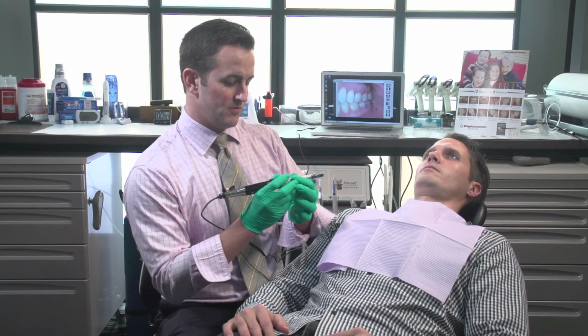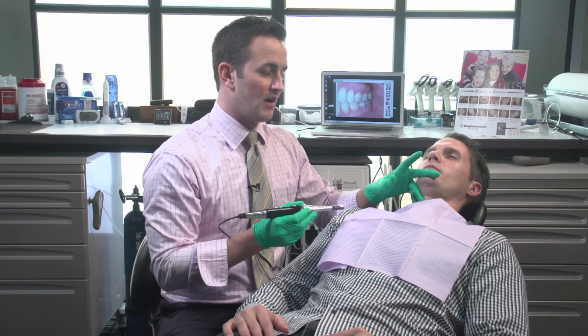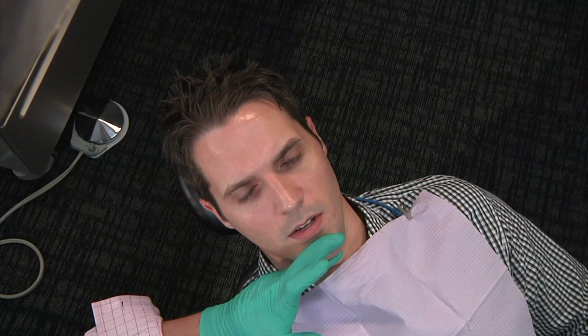Camera's already on too. Now with your opposing hand, we're going to place the middle finger off the labiomental groove and basically pinch down on the chin. Have the patient open up, lean towards. You want to get a visual spot check of where you're placing the camera with your opposing hand index on the camera placing down. It's going to help it from slipping off the occlusal surface.